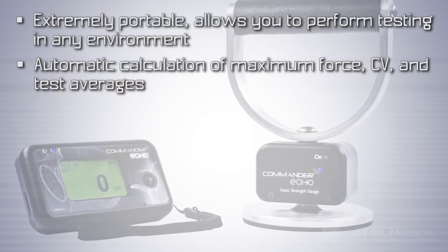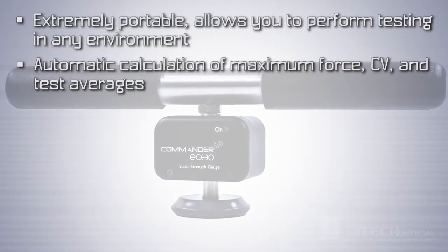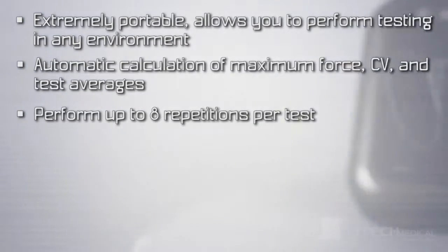Automatic calculation of maximum force, coefficient of variation, and test averages. You can perform up to eight repetitions per test.